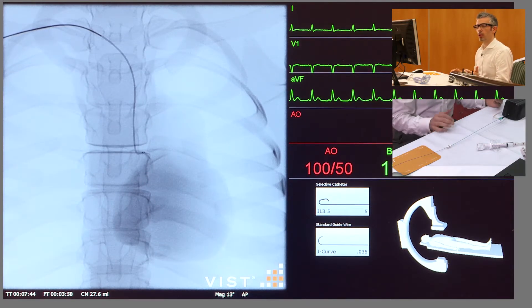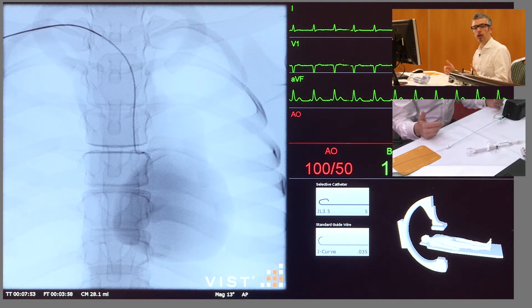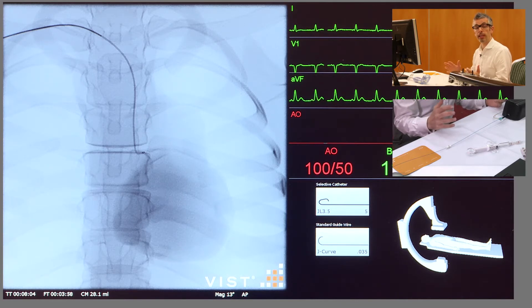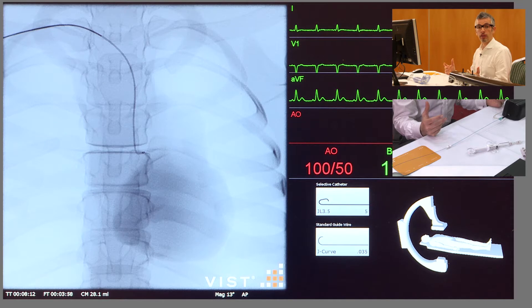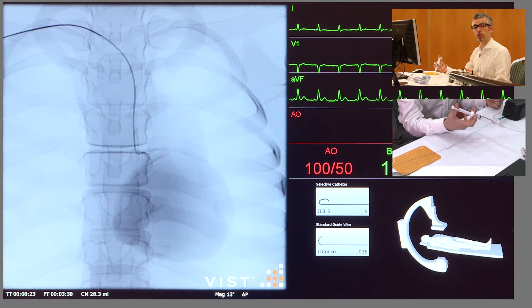Now we need to know where we are in relation to the left main coronary ostium at this point, so we can take a small scouting shot. We connect up our giving set, ensuring that we have no air inside the system. Before taking any shots however, it's very important that you always look at the pressure tracing — you should do that before you take any injection. That's to ensure there isn't any damping of the pressure trace, which might suggest that the catheter is either up against the wall of the aorta or the wall of the left main stem, or it's found its way into a small branch vessel, either of which might be dangerous if you were to inject at that time.